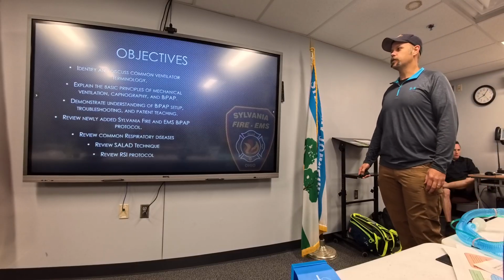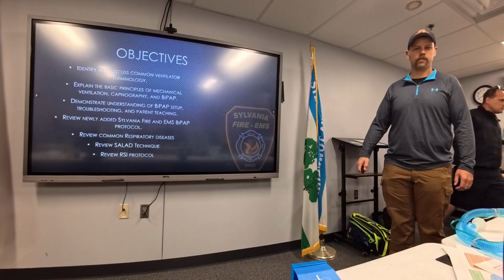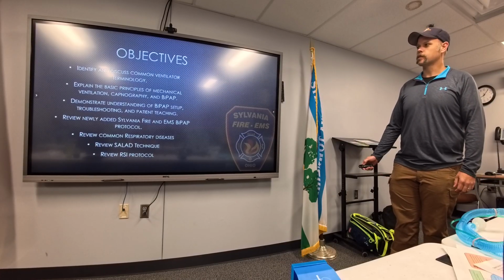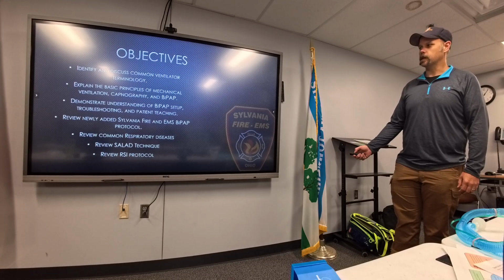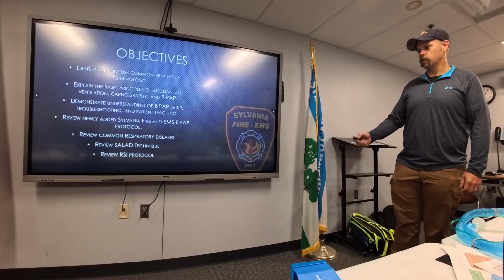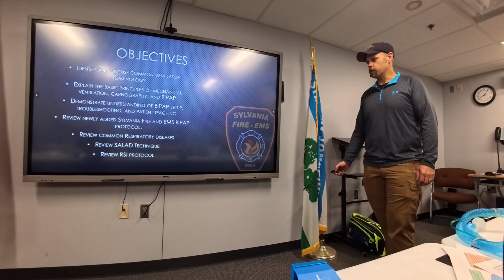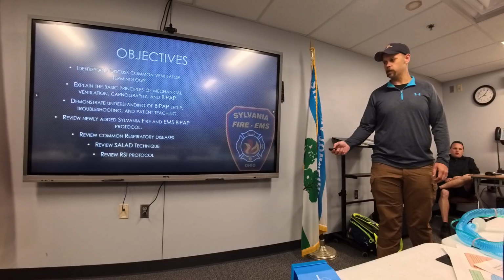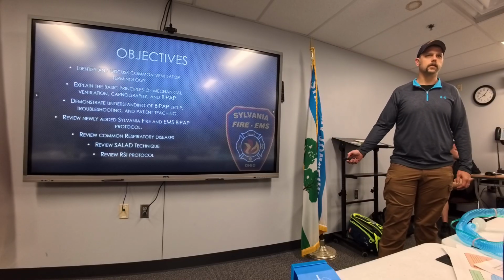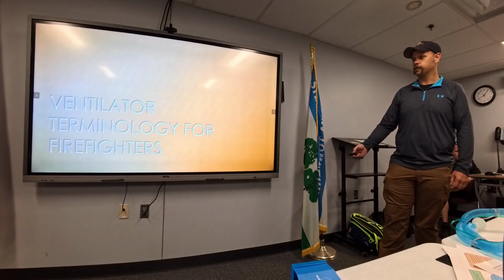Our objectives: identify and discuss common vent terminology. There is a lot that goes behind the vents and all these different meanings. We're going to go over a lot of that. Explain the principles of mechanical ventilation, capnography, and BiPAP. Demonstrate the understanding of BiPAP setup, troubleshooting, and patient teaching. Review the new Sylvania Fire and EMS BiPAP protocol. Talk about some common respiratory diseases. Talk about SALAD technique. And then we're going to also review our RSI protocol. This is RSI month, so everybody's going to get a chance to go over that in the skills station.